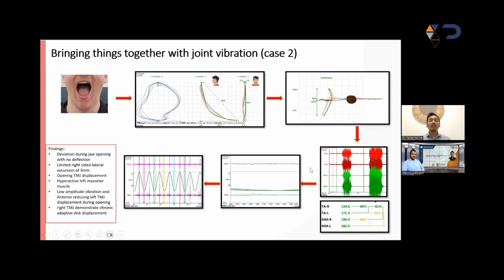So you can get all of that right there on paper with supporting evidence should you decide that, okay, this needs a specialist referral or this needs an MRI to back this up. And it serves as a justification, especially when you ask a patient to do a CT scan and they're concerned about the radiation and they keep asking you for justification. You can't just tell them that I heard a pop, I see your jaw moving, I feel like you're having pain, that's why I need you to do this. This serves as a more fundamental or strong reinforcement technique right here.